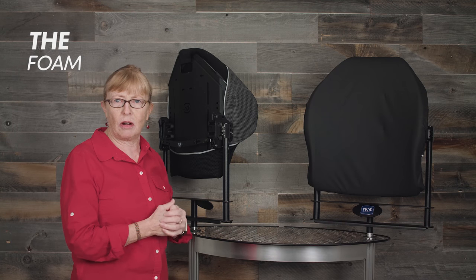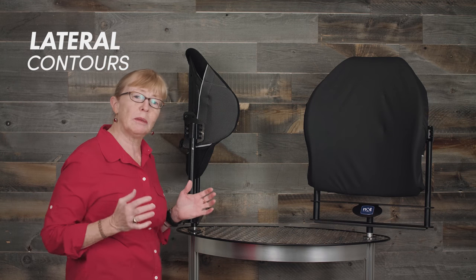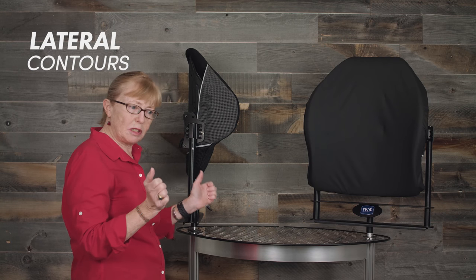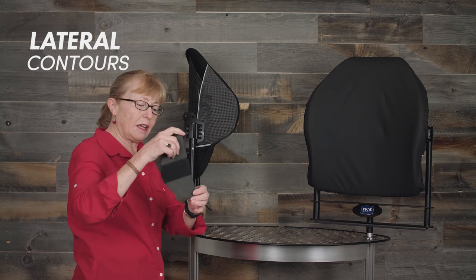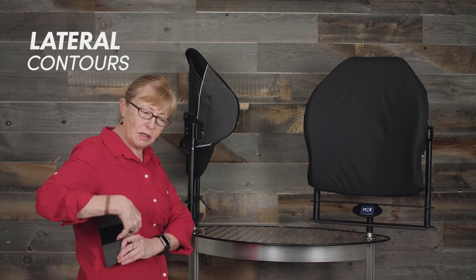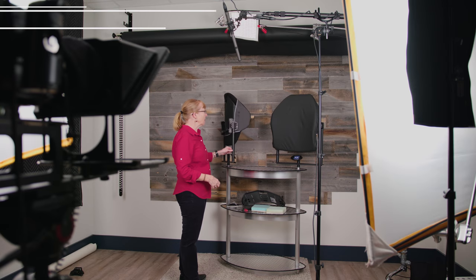All the foam also extends beyond the edge of the frame so that you get good coverage and you're not pressing up against the hard aluminum frame. The back supports all have lateral contours made of aluminum, which allows you to bend the lateral contour in or pull it out depending on the person using it. You can also slide in extra foam support to give additional support there.